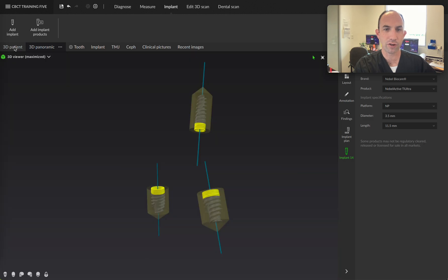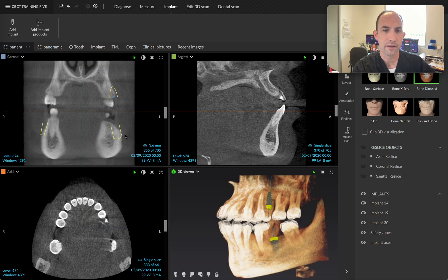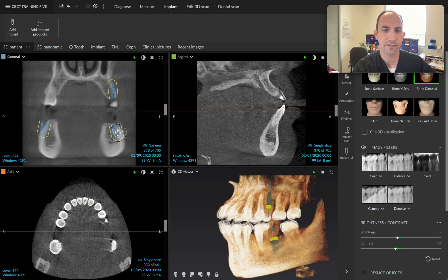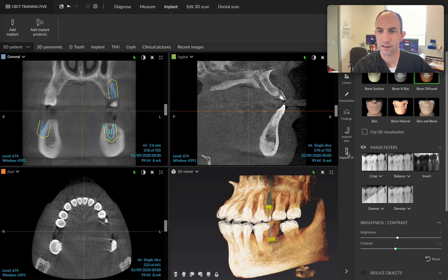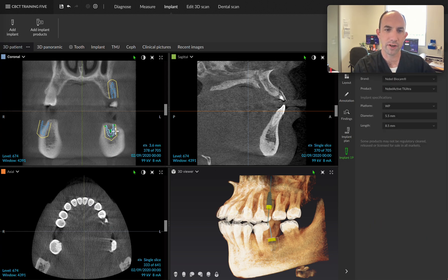I'm going to go to 3D patient and double-click to get back out of this screen. You can see they're a little bit outside of where we want them to be. So I'm going to scroll to roughly where they are and start dragging them around. The same rotate tool is available. At this point, that may be a little too close to the nerve for me. So I'm going to click on implant 19 and change that to a shorter implant. Okay, feel better about that.